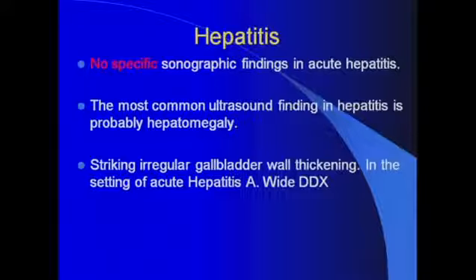Now, in addition to that, there are other findings that can help you come to the right diagnosis in the right clinical setting, i.e. that the clinicians are suspecting the patient is having an acute problem with their liver.